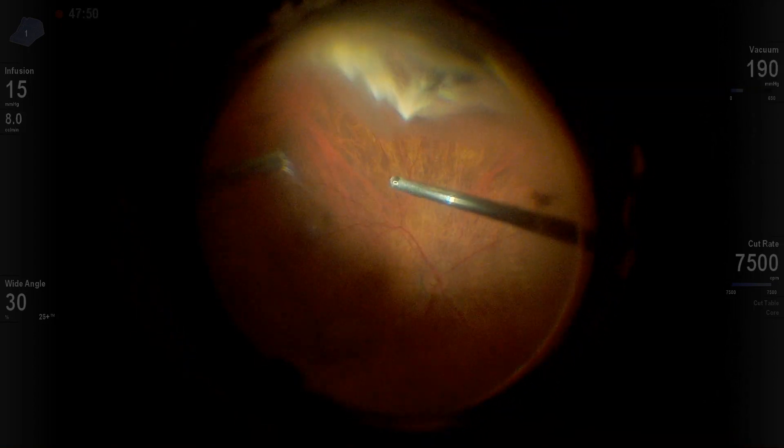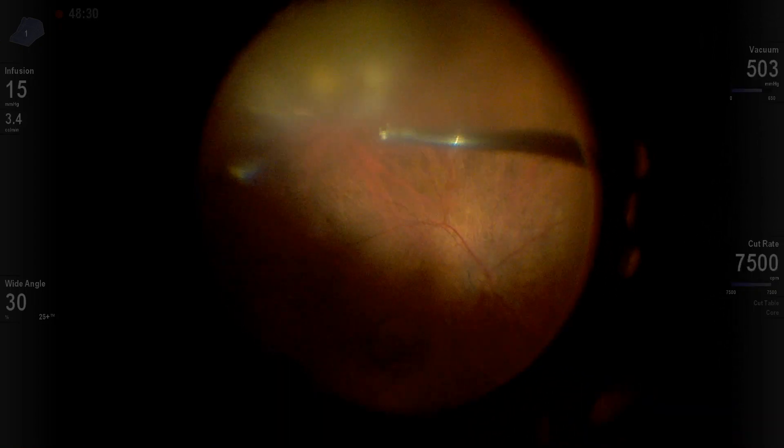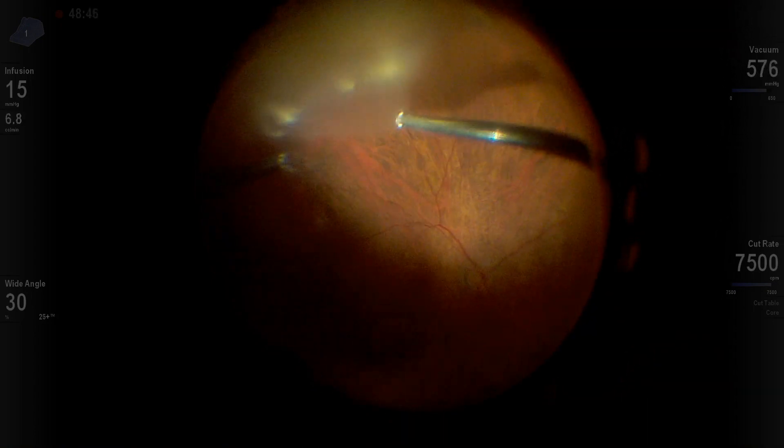Here's the step of inferior indentation. What you want to see is a view where you can see the vitreous and the retina — that's the best view you can get from your assistant.